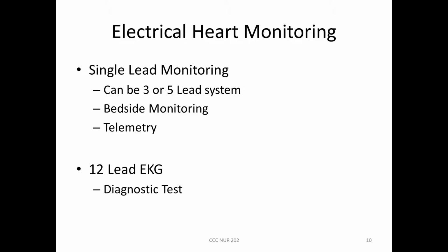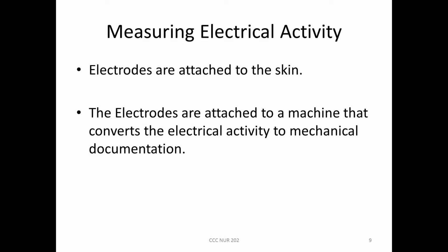It picks up on ischemias. Physicians will be able to look at that to diagnose dysrhythmias and conditions of the heart. I'm sure there are a lot of savvy nurses out there, especially ICU nurses, who have been there a while and can also look at a 12-lead EKG, but we are not there to diagnose at all, only to monitor.